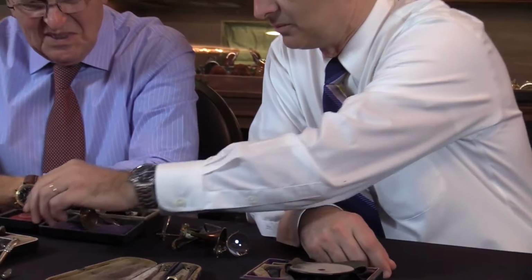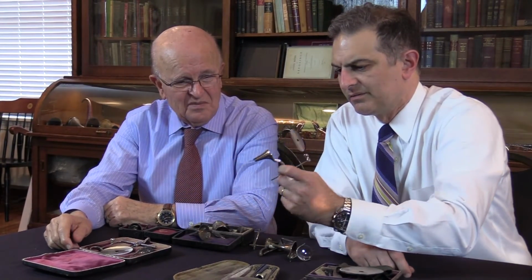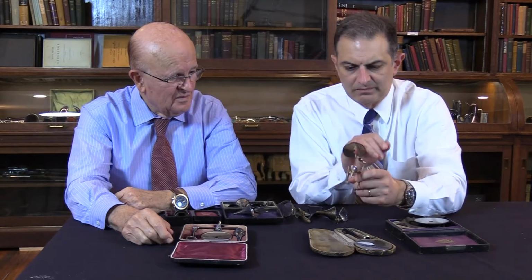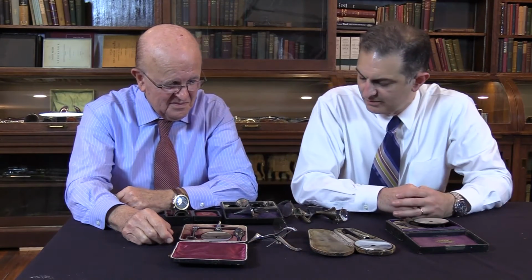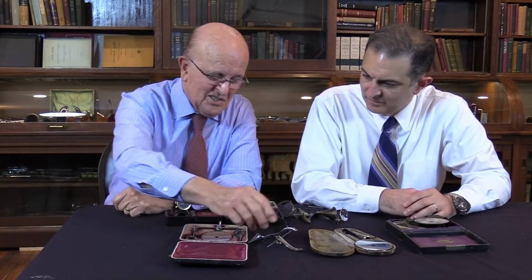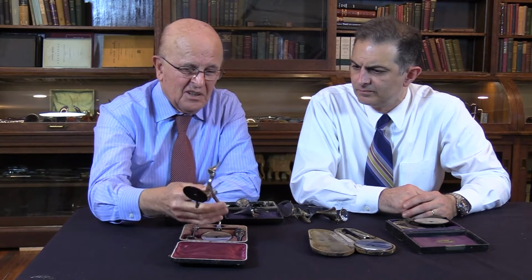And then similarly, this device here keeps you with one hand free if you need to clean. You have the bivalve speculum with the mirror, and you can look through and focus your beam that way. So it's a pretty interesting evolution of the speculum and trying to get light into the ear and be able to see a little better. And just a side comment, we saw the Kramer's bivalve.